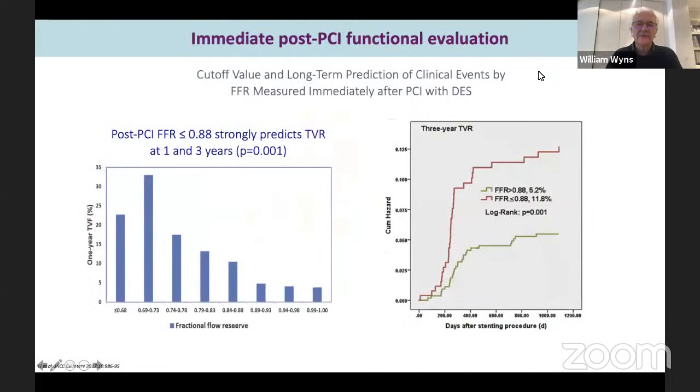Exactly, and that is what matters, because what matters for patient outcome is the conductance of the vessel you've treated when they leave the cath lab. And I can't stop showing this slide. This is from Barbato's work, I think, or Lee. You see the fractional flow reserve at the end of the case. You say to the patient, fantastic, good result. We know that in a number of cases, the final FFR will not be that good. It may even be below 0.9, in this case, below 0.88.